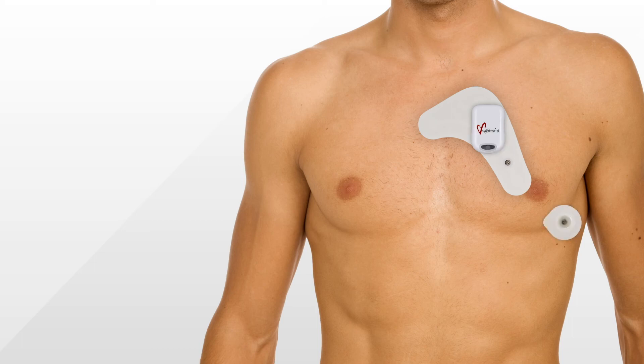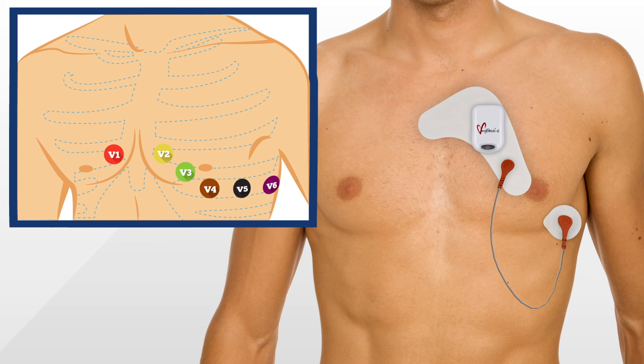If you have attached the lead wire to the MyPatch SL electrode for 3-channel recording, attach the standard electrode to the V5 position on the patient's chest. The recorder will automatically begin recording once the green light stops flashing.